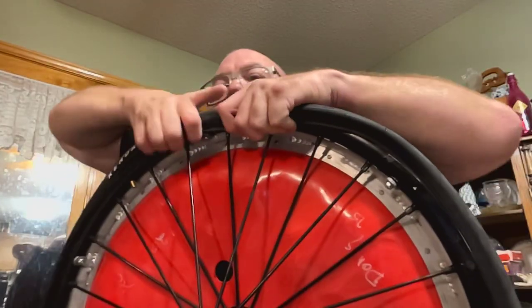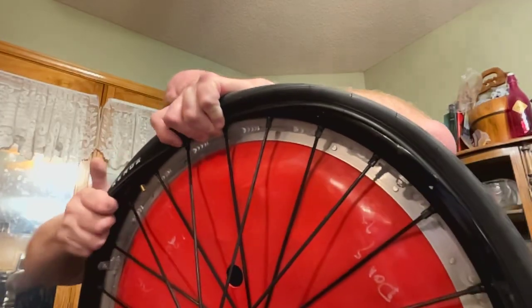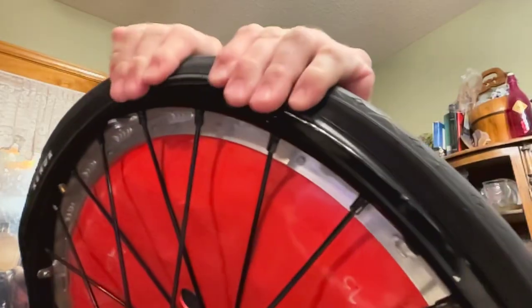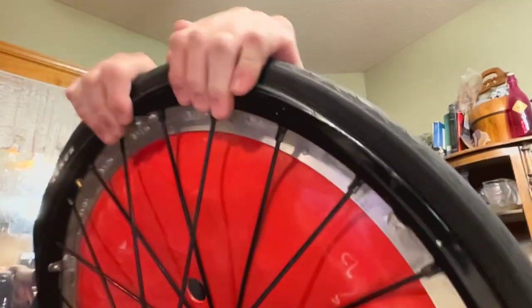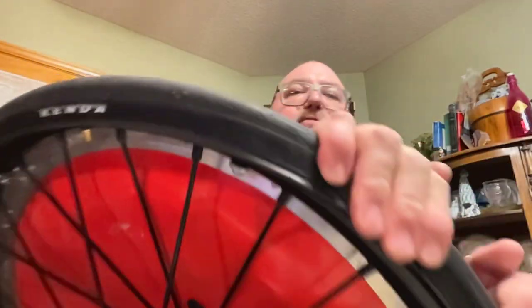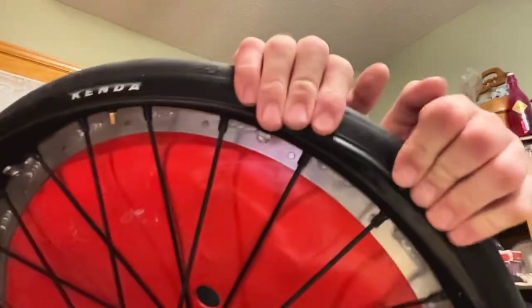Oh, I missed that one. So ideally what I'm wanting to see is I want that to be equal there. So I just kind of keep on working it over. I'm using my contracture a lot to be able to do that. So I'm actually using my shoulders and my upper torso to kind of roll that in. I know you can't see what I'm doing, but I'm actually using my back muscles to push that in.